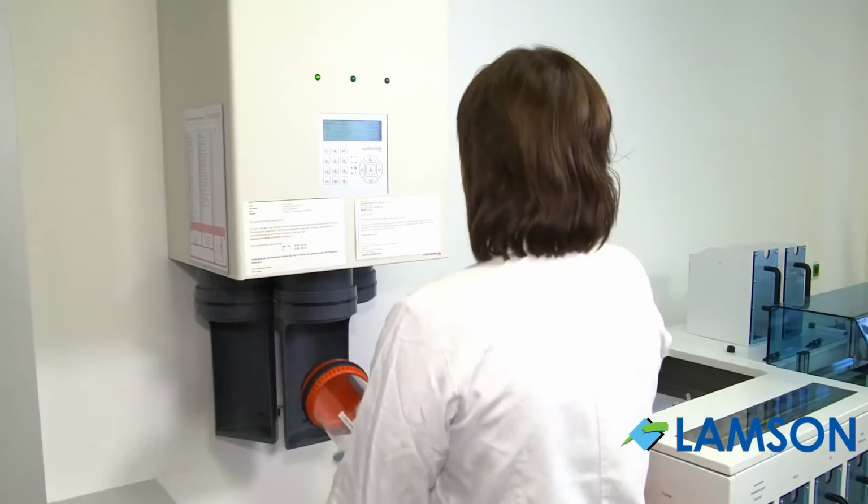That's why the tube bombs have RFID chips. We can put them into the sending station, and they automatically go back to their home address. The tube bombs, well, that kind of became a common term for the carriers here.